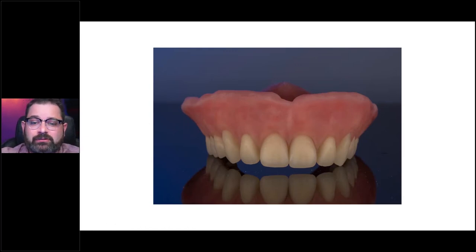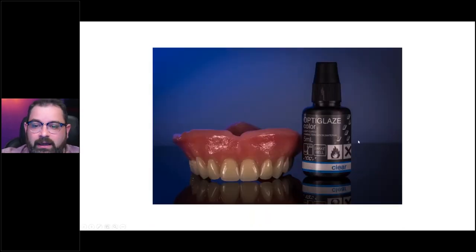I'm a big fan of glazing my restorations. The way I do it is once I've applied and cured my Gradia Plus, I polish it slightly with pumice just to get rid of any sharp peaks. Then I clean it and sandblast it with the same aluminum oxide. Once I do that, I clean and dry it completely. Then I apply my OptiGlaze — in this case I'm using OptiGlaze Color Clear from the kit, but you can use the black bottle OptiGlaze as well.